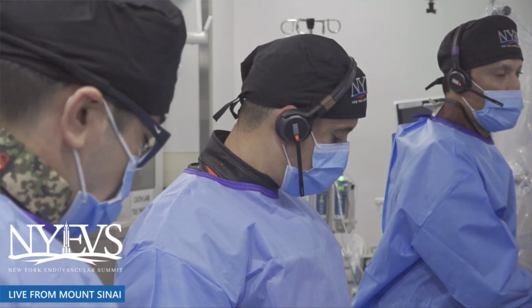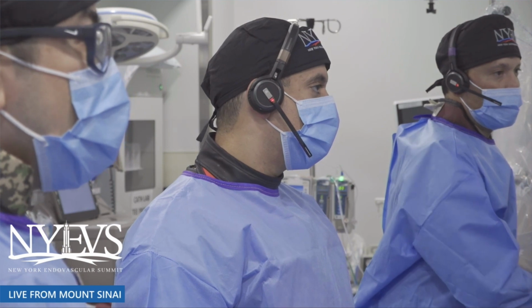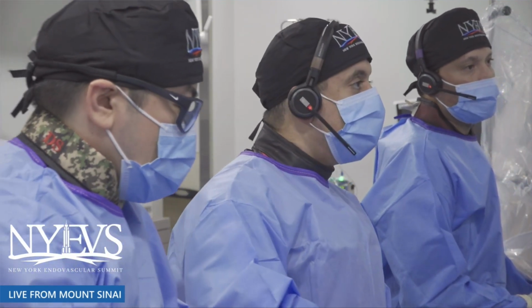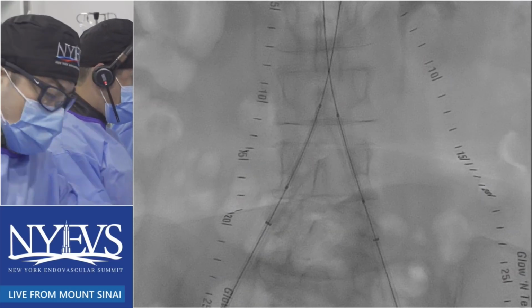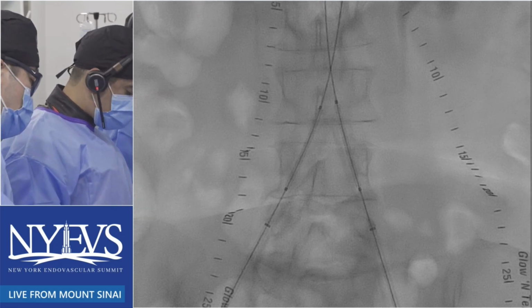I think the other thing, PK, is that the subgroup analysis favored balloon expandable in calcium, but they weren't very specific about the kind of calcium. And I think here we're all getting caught by that one area of really eccentric calcium, and that may be making us think differently.